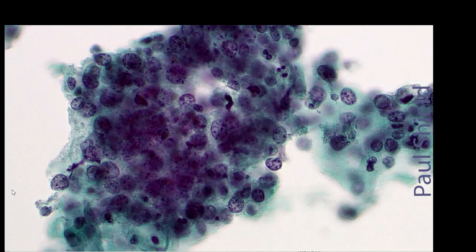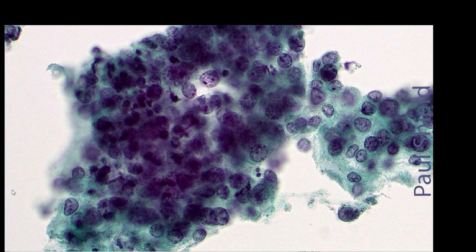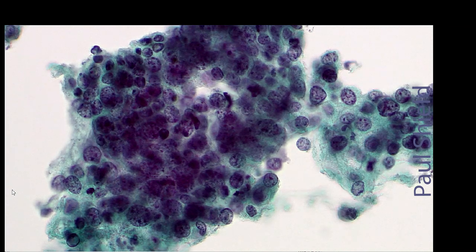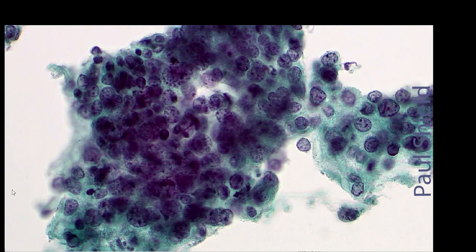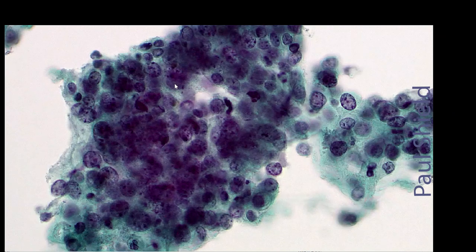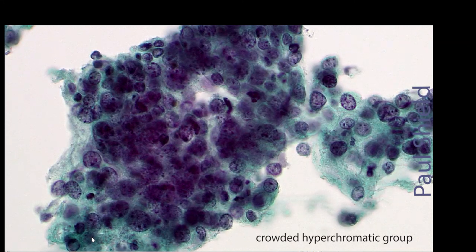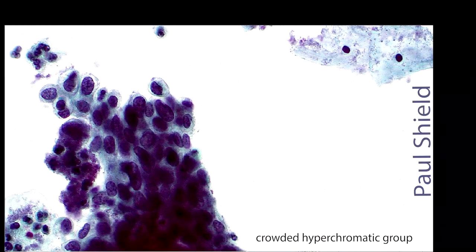And as I do that, you can see how variable the nuclei are. They're all hyperchromatic, but the chromatin pattern on them is varying quite a lot. The size and shape of them, see that one there is quite spotty like a leopard, and there are very different shapes, like compare small nuclei to large ones with their neighbours.